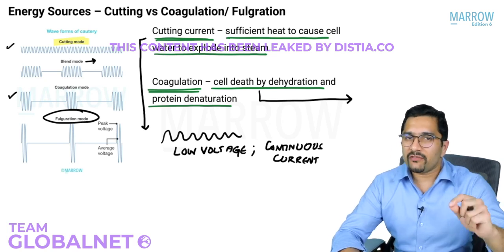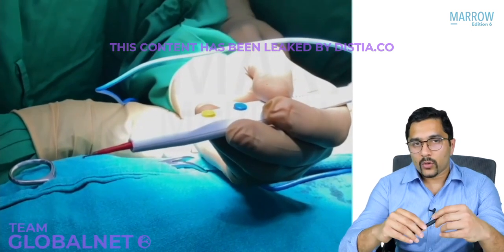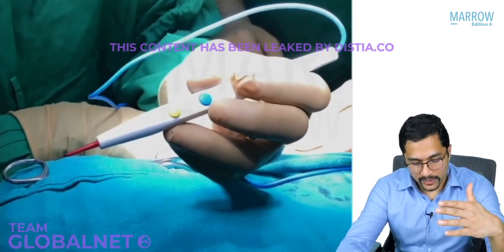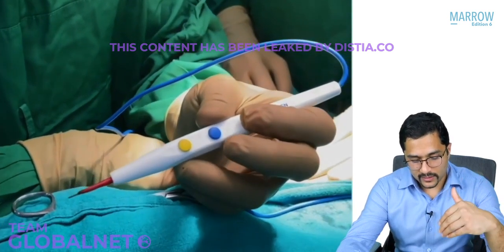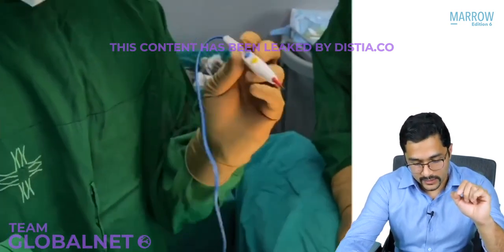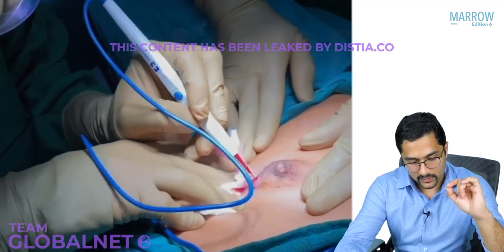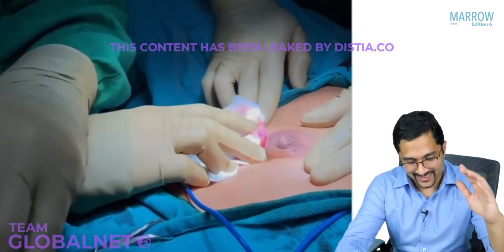Now let me quickly show you a video of monopolar cautery and then we move on to bipolar cautery. So you can see this is the monopolar cautery. It looks like a pencil and there is a yellow button and a blue button. And if I press the yellow button, then cutting is going to happen. And if I press the blue button, then coagulation will happen. So you will see here, now I'm going to use the yellow button to increase the incision. So here I'm using the yellow button and I'm going to cut the subcutaneous tissue with the yellow. After pressing the yellow button, that is the cutting current.